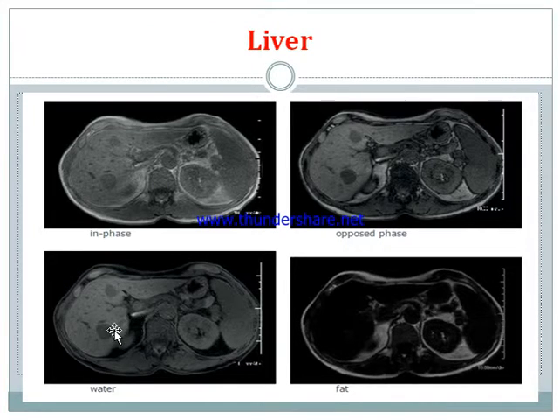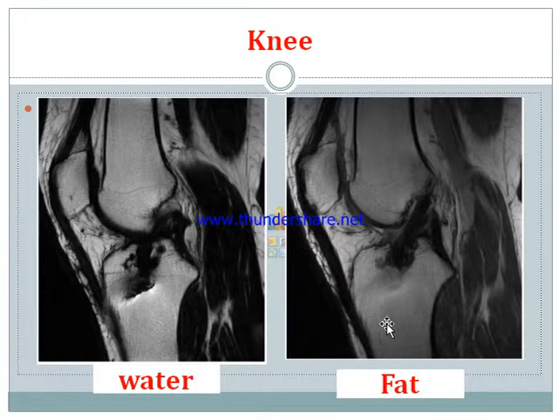From this image we can see there are two lesions, and we can see the difference between this one and the in-phase image, and this is quite good compared with this one. Another thing, we cannot see much in the fat image in this case. However, fat image can be very useful in other cases, especially in bone imaging. For example, in these two images we can see the fat signal is quite good, and fat signal is good when imaging bone because bone doesn't have much water.